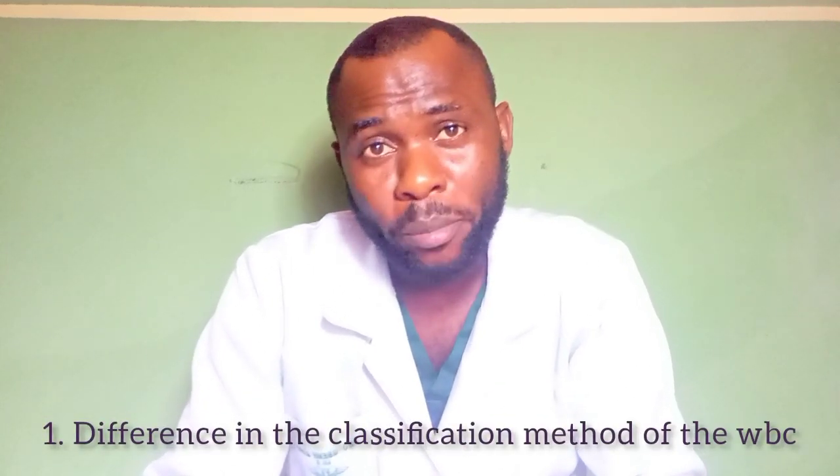So one is the difference in the classification method of the white blood cells. The 3-part auto analyzers classify or differentiate the white blood cells into 3: the lymphocytes, the granulocytes, and of course the monocytes. While the 5-part auto analyzers classify or differentiate white blood cells into 5 parts. That is the lymphocytes, the neutrophils, the monocytes, eosinophils, and of course the basophils.